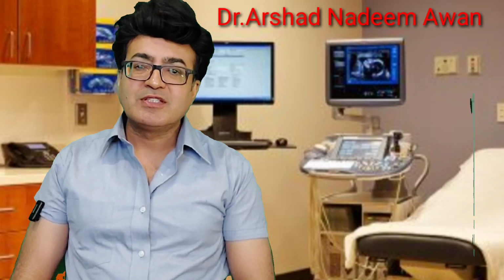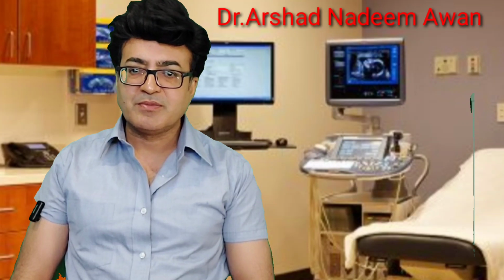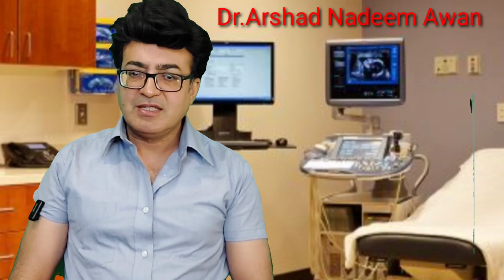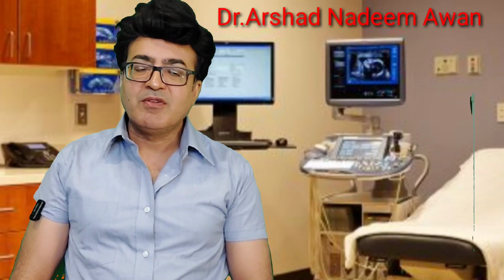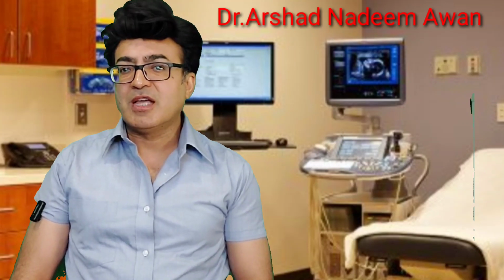Today my topic of discussion is quite important, and every now and then you will come across this term, that is PID. PID is abbreviated as pelvic inflammatory disease, which is very common and increasing in frequency. So far as pelvic inflammatory disease is concerned, it is caused by certain abnormalities.